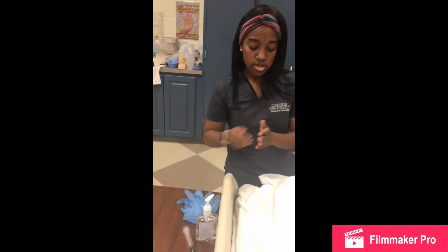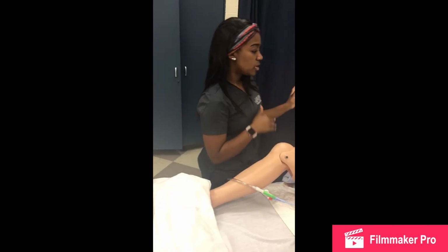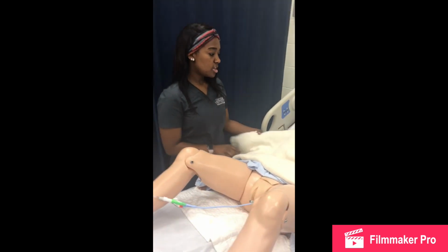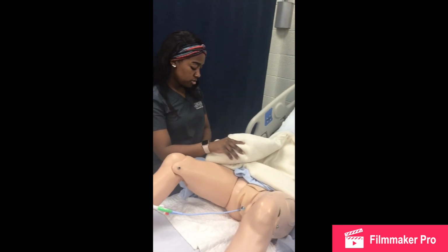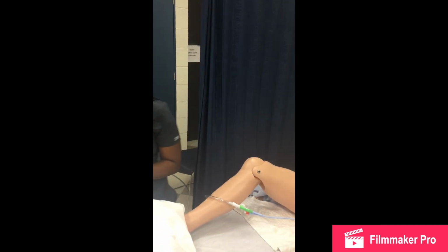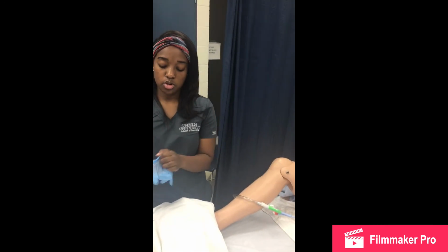Okay, so now I'm going to go back into my patient's room because we're ready to remove the catheter. I'm going to wash my hands, and I'm going to explain the procedure. Hi, my name is Naima Lawson. I will be your student nurse today. Can you please verify your name and date of birth? Okay, great. Today we're going to take out your catheter. This is a clean procedure, not a sterile procedure, so I'm going to put on clean gloves.